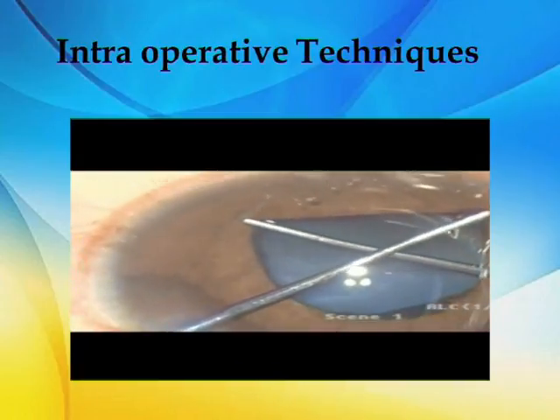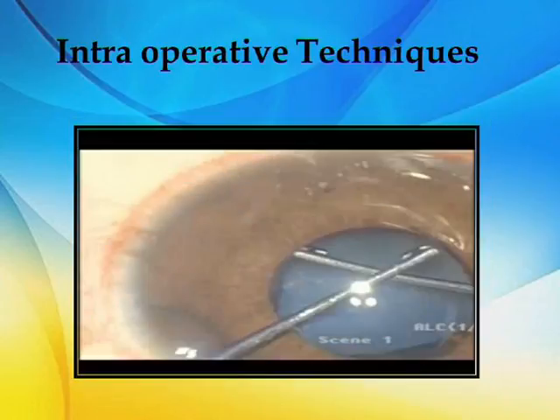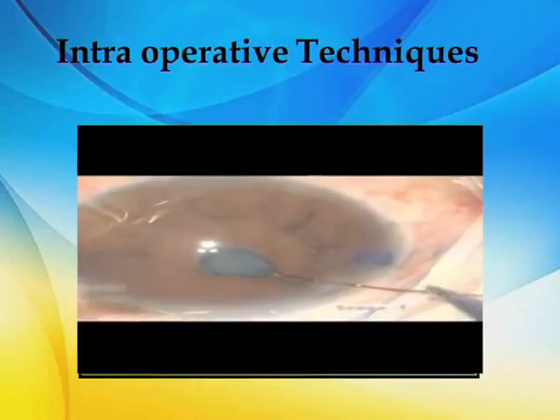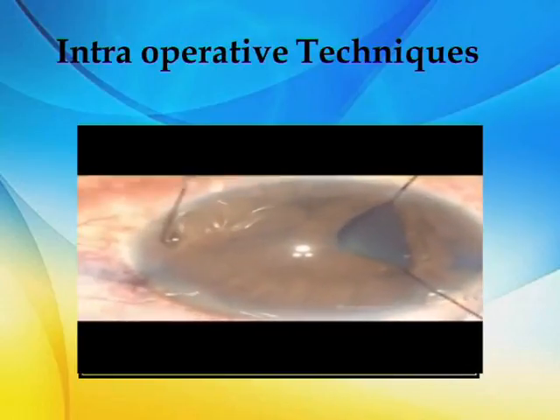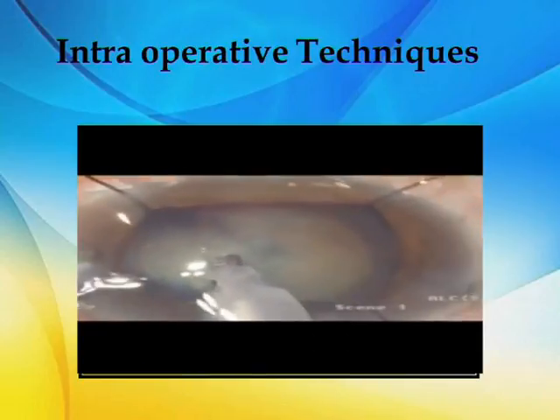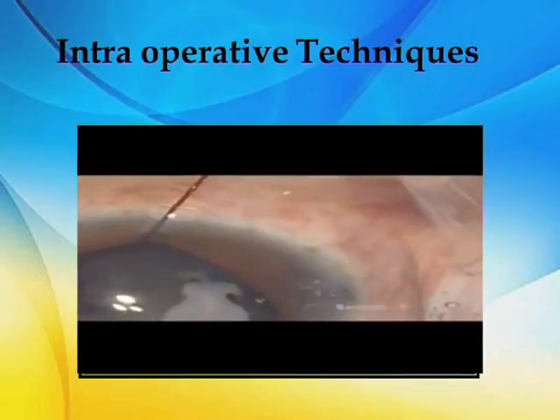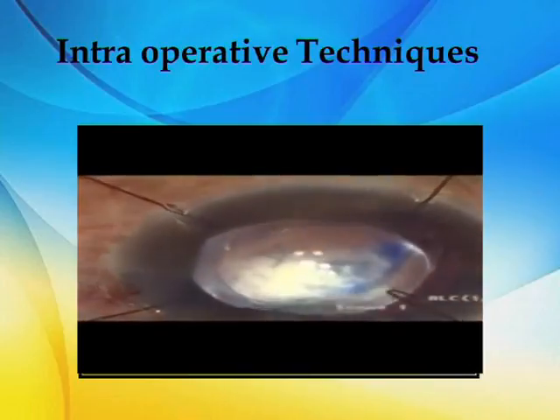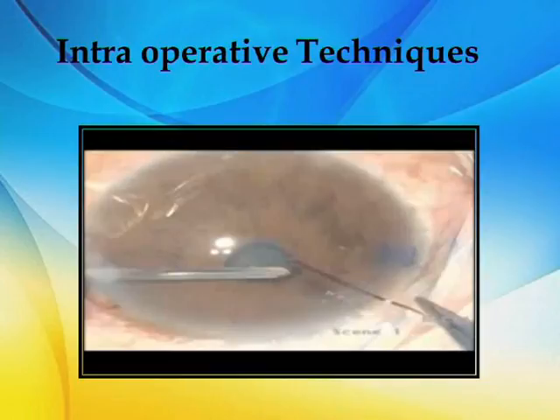See, this is the pupillary dilatation. The stretching is happening in diagonally opposite directions to make the pupil a little more dilated and have a better view for surgery. This is another technique using the iris hooks. Again, here you can expect more iris trauma. Nowadays, instead of 4 hooks, we prefer 5 iris hooks for better stability and to prevent iris prolapse in these cases. And the staining can also be done with trypan blue in all these types of complicated cataracts.